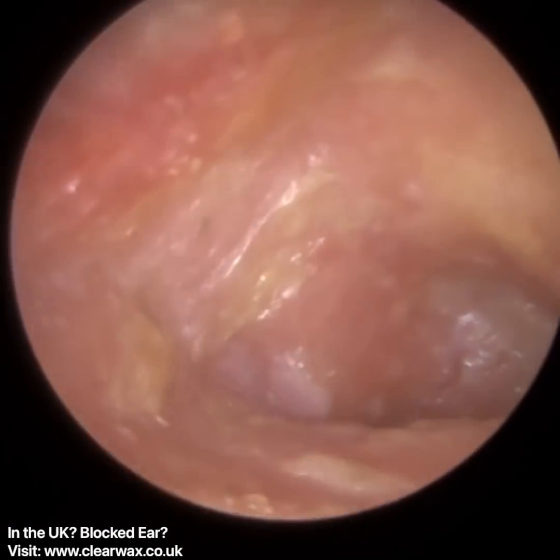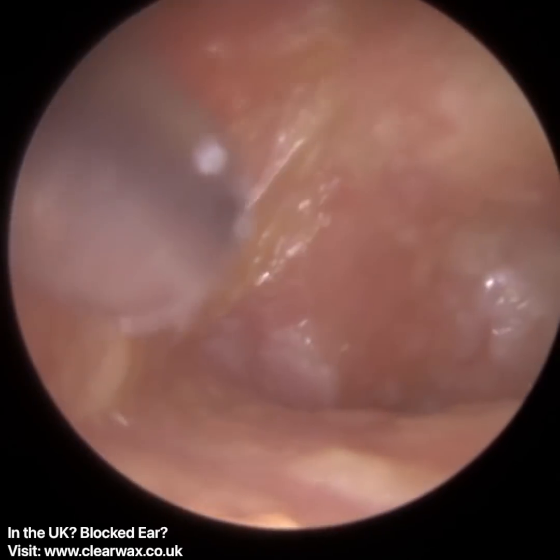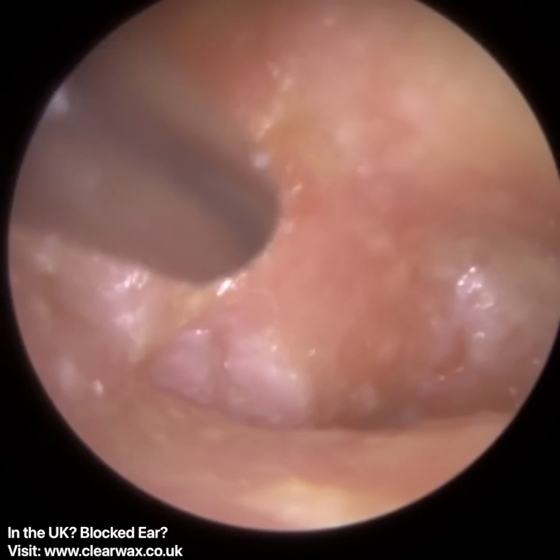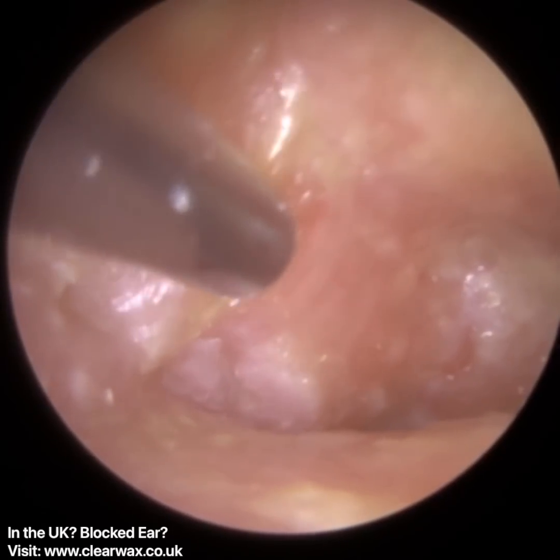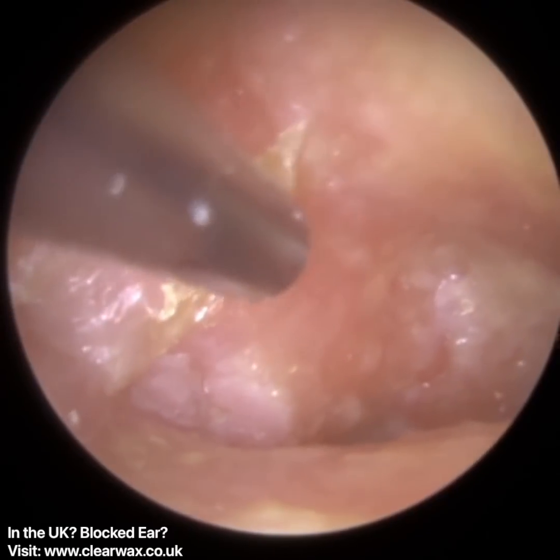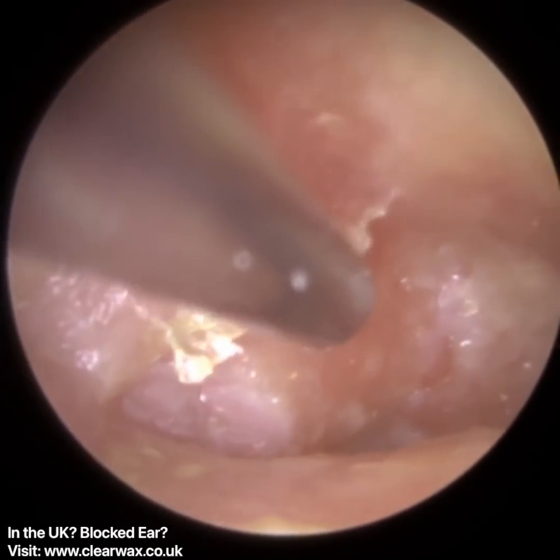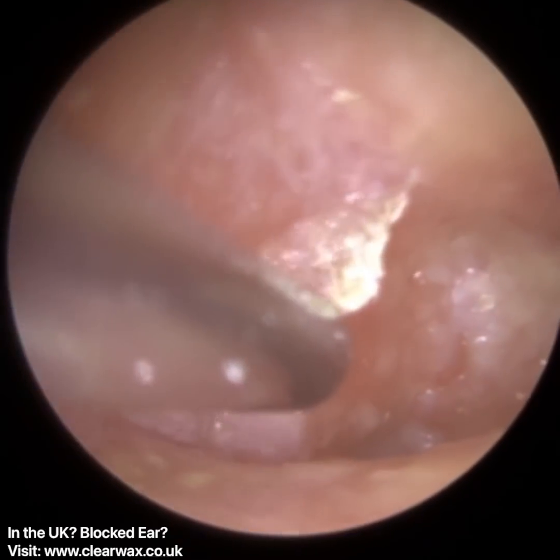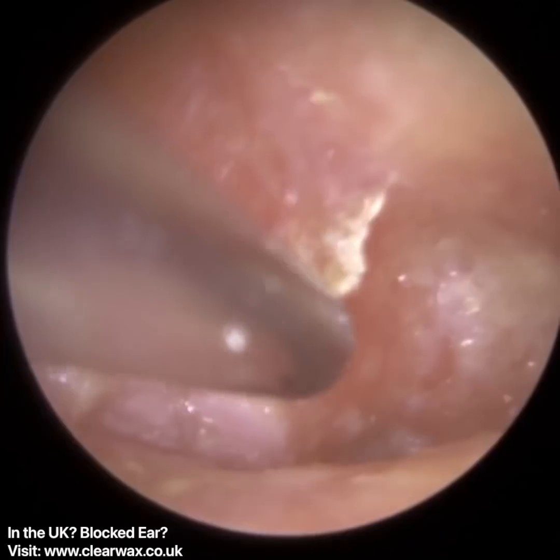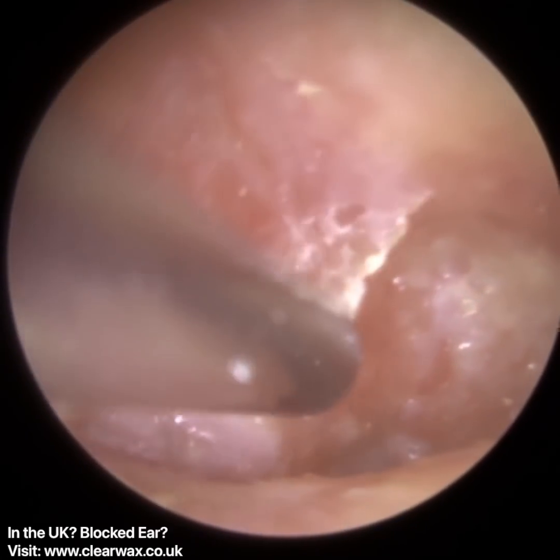But I just want to get a bit more dead skin off on the superior canal wall, so the top part of the ear canal, and also there's a bit here on the eardrum. Now again, if I was teaching clear wax delegates, I would advise them not to worry about this until they've gained a lot more experience and skills. Not something you would do as a beginner or someone who's just qualified. You need a lot of experience, you need a steady hand as well, because we're right on the eardrum here, and you can just see the view offered by the EarClear scope.